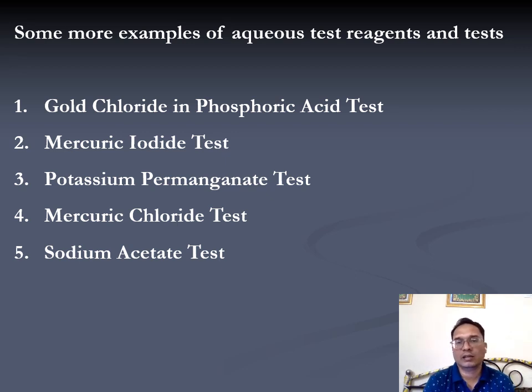So these chemical screening tests and the microcrystal techniques are very important, and these are the preliminary tools for our forensic chemists. By using this test and this technique, the chemist is able to identify the probable presence of a particular controlled substance. And depending on the results obtained in chemical test and microcrystal technique, the suitable analytical procedure can be designed, it can be framed, and the compound will be identified.